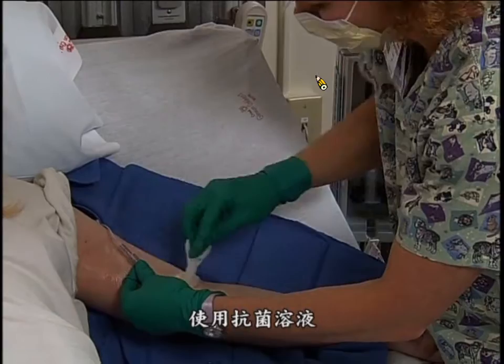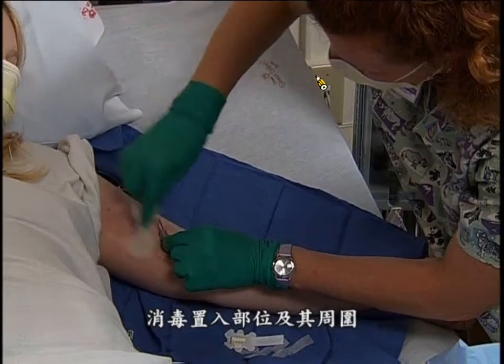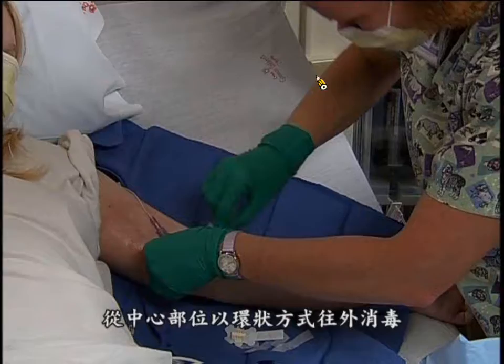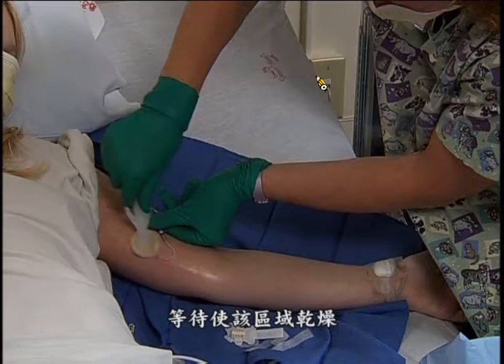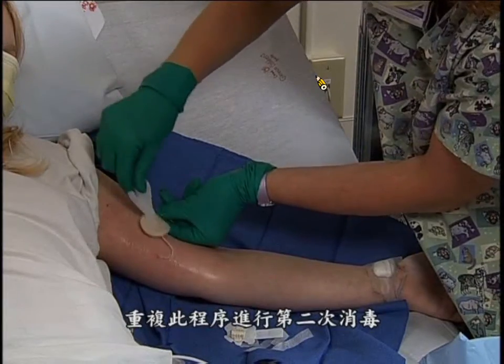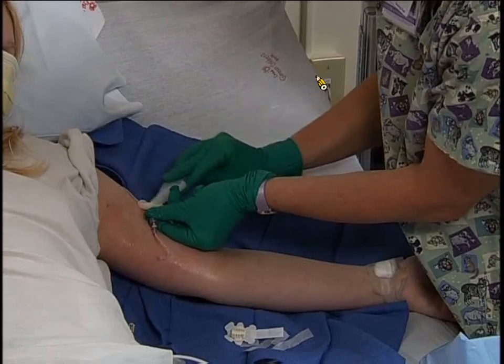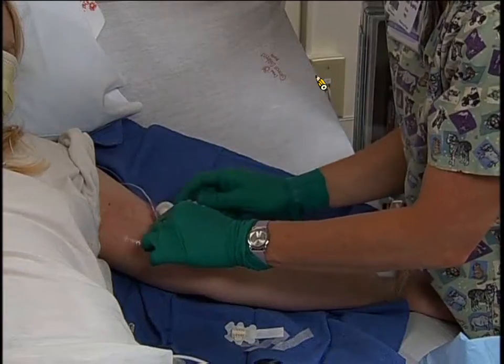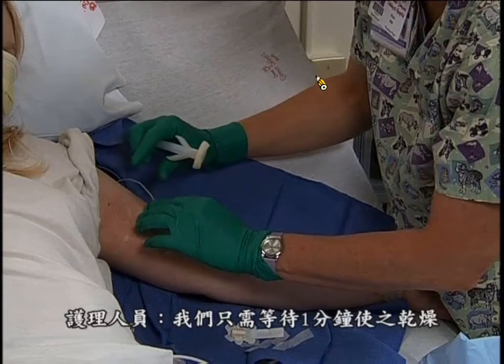Using antiseptic solution, clean the insertion site and the surrounding area, moving in circles from the center outward. Then let the area dry. Repeat this process with a second antiseptic applicator. And we just have to let that dry for a minute.